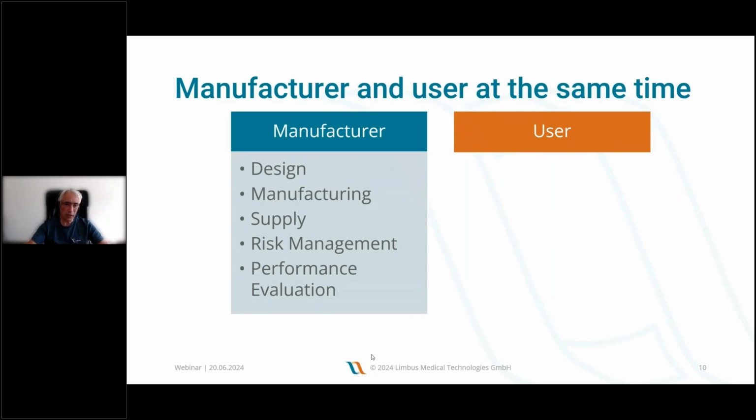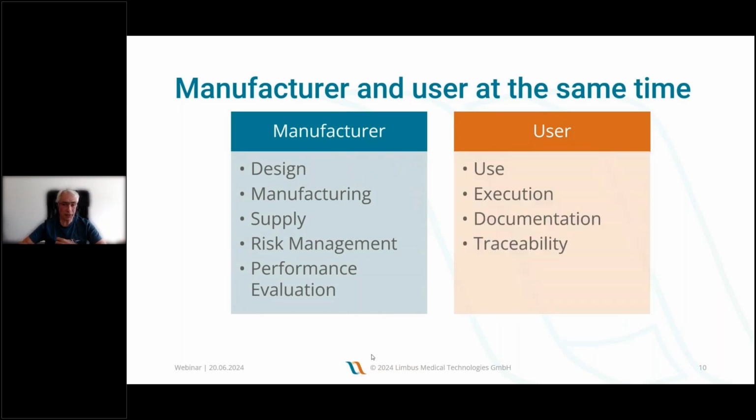As the manufacturer of your in-house test, you are responsible for the design, manufacturing, your supply chain, and for the risk analysis, for example, and also for the performance evaluation. But these are processes that you perform probably once or several times when you update the design of your in-house test. But this is separate from the execution of the test. That's something that you do in your routine diagnostics.